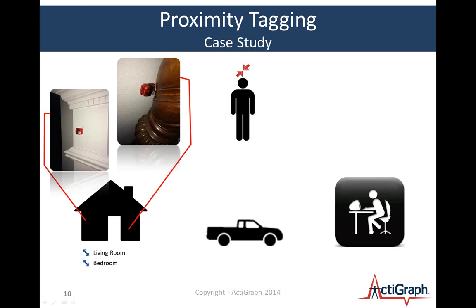It was asked earlier in the first webinar, and the way it was asked was, couldn't we just have the device act as a beacon for 59 seconds and then have it look for other beacons for 1 second? Yeah, that's something we're going to explore because honestly, we looked at doing that initially, and I think there must have been some hardware technical challenges with that, with getting the firmware to work properly. And so I'm going to defer to our hardware department. I'm really the software department here, but I'll defer to them to look at that and discern whether that's an option or not. But that's a great question. It's been asked twice today, so I think it's definitely something we need to look into. So thank you for that.